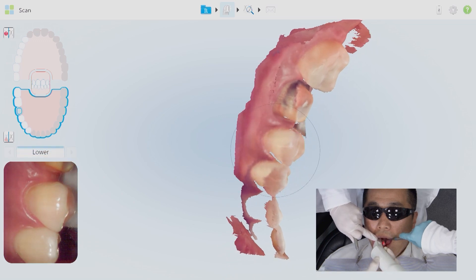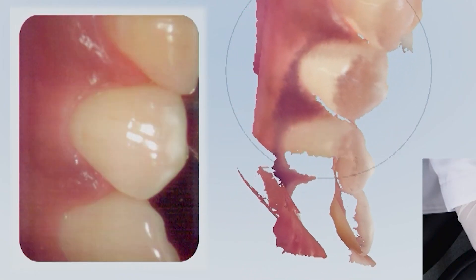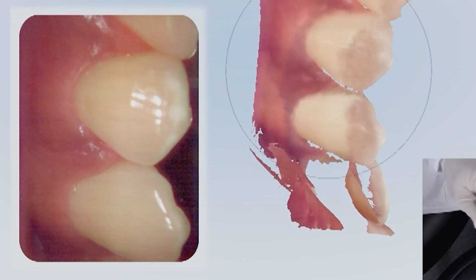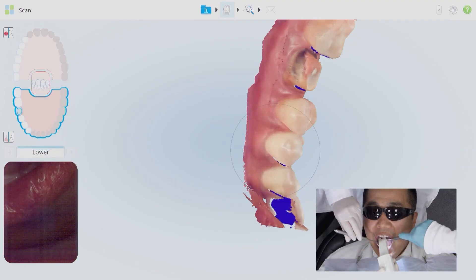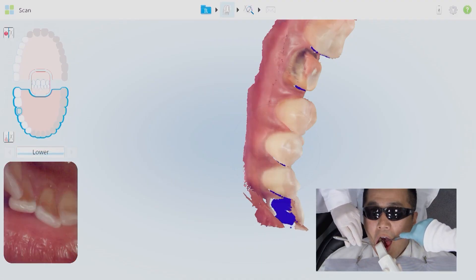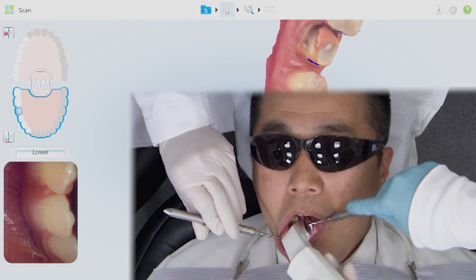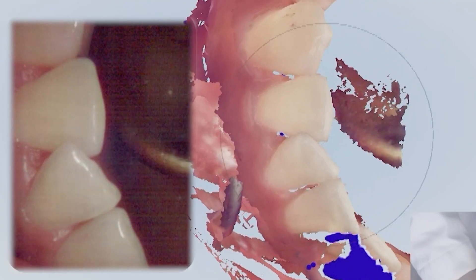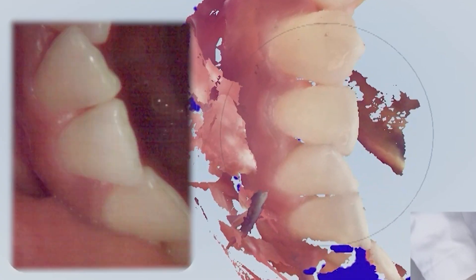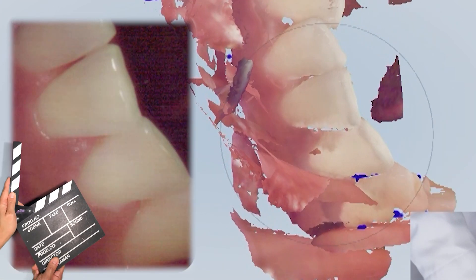As I work my way toward the mesial, the camera has less of an ability to retract this lower lip, so I may need to go back in there and have the patient close slightly. Once they close, it actually releases some of the soft tissue so you can rotate and visualize these areas near the front.